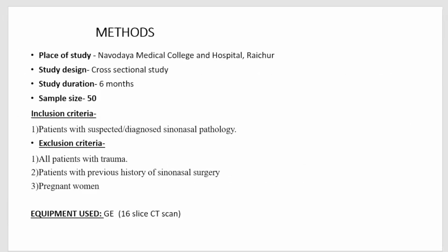And methods. The place of study is Navodaya Medical College and Hospital, Raichur. The study design is a cross-sectional study, the study duration is 6 months, and the sample size is 50. Inclusion criteria include patients with suspected or diagnosed sinonasal pathology. Exclusion criteria include all patients with trauma, patients with a previous history of sinonasal surgery, and pregnant women. Equipment used is a GE 16-slice CT.